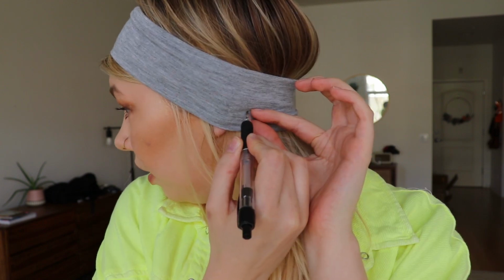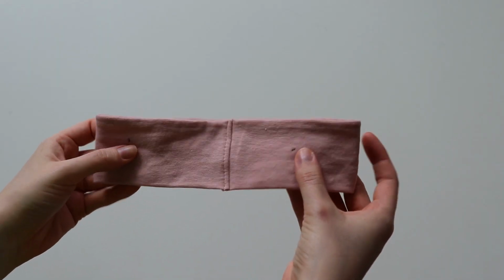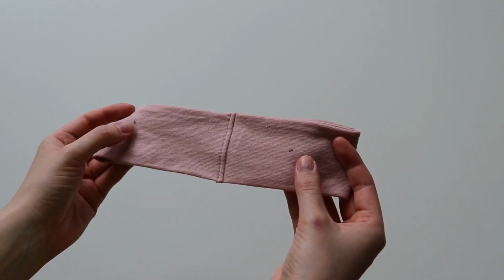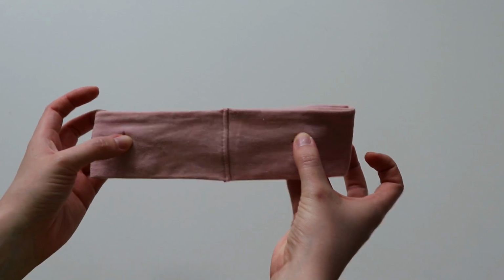And where you want this is behind the ear. Somewhere around here. I'm just gonna make a little bit of a mark so that when they have the masks on, it's still able to pull tight and hold on to something, but it doesn't have to be pulling on their ears all day and rubbing against it. So just do the same thing with the other side. Again, if this is on your person, it's gonna be a little bit better, but leaving me with something roughly like this. If yours, like on this one, I do have this up a little bit higher than this, I am just gonna compensate and kind of meet in the middle.